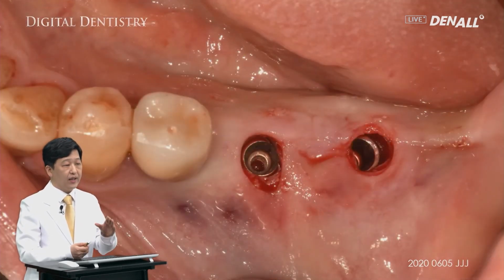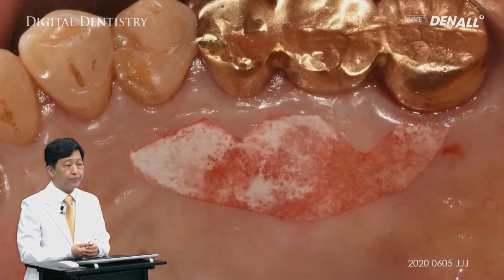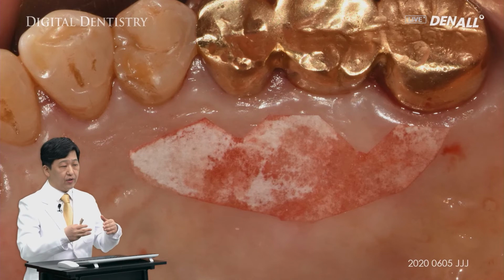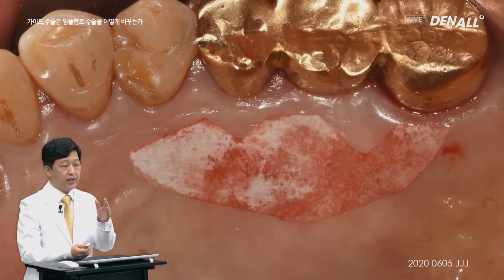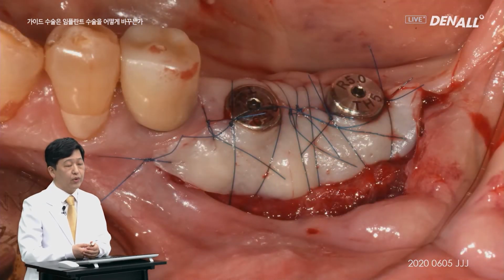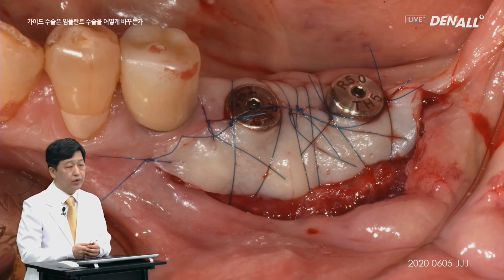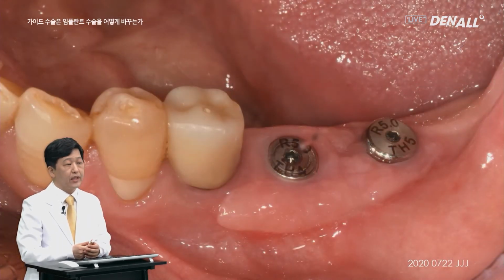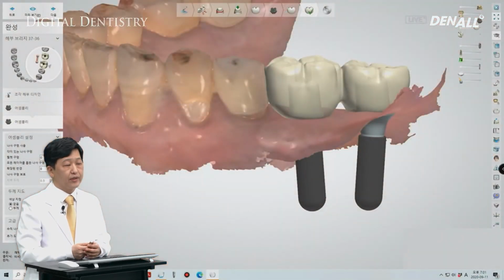In the desired position, implants were placed using the guide and healing abutments were connected and a bed was formed. Soft tissue was grafted from the maxilla in the desired form. Graft was done like this. Soft tissue graft is now complete. You can see that there's keratinized tissue around the abutment.